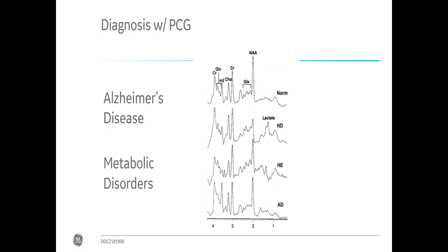And therefore, already by so-called pattern recognition, by really looking at the pattern of the spectra, you can distinguish between different diseases, or you can confirm different diseases. You need to always take into account that spectroscopy is never done alone, so you will always have the history of the patient, you always have the imaging, so it adds extra information.